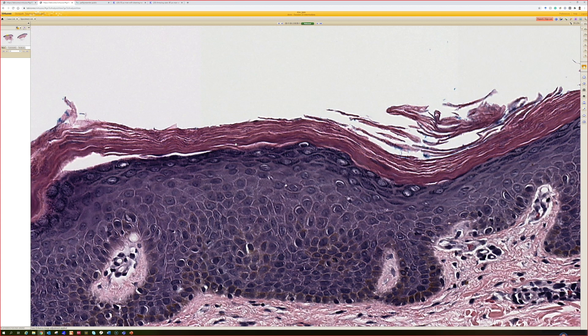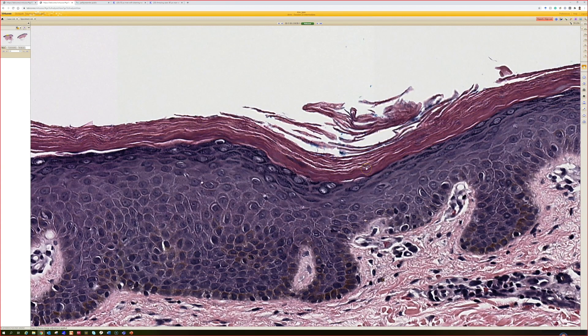Just like looking for fungus — I essentially always look for fungus in the groin unless I've got some other diagnosis. PAS I pretty much routinely do in genital skin for rashes, unless I see obvious lichen sclerosis or something like that, because it's an easily treatable thing that you can solve the problem with right away. So with compact ortho: look for candida, look for dermatophyte, look for erythrasma.